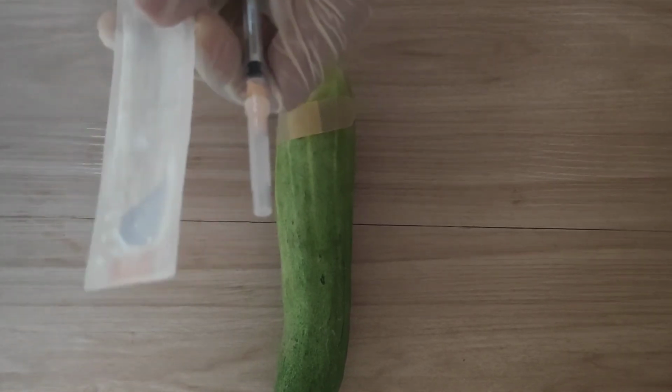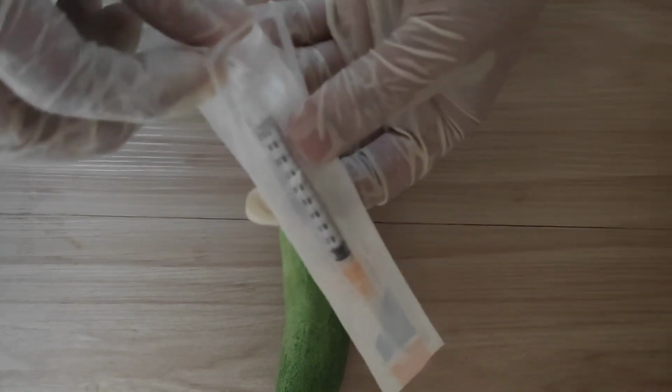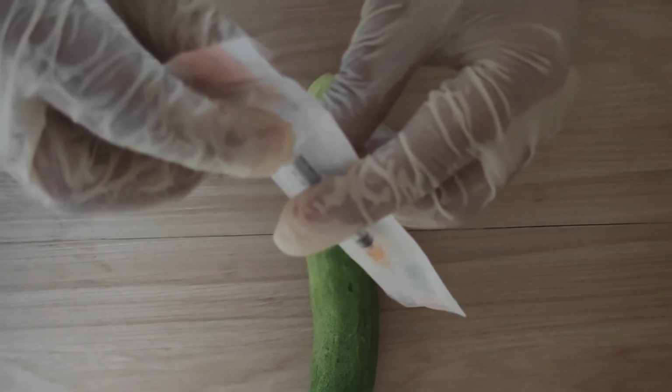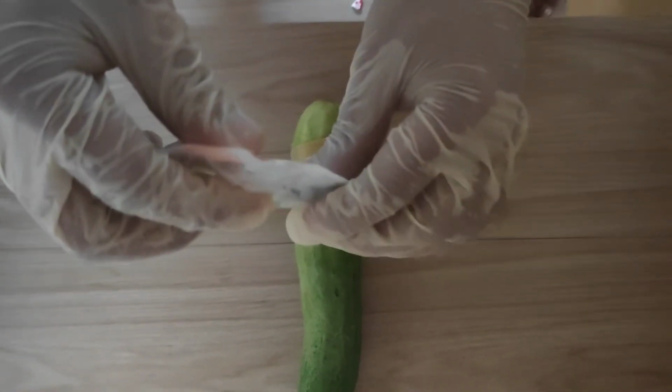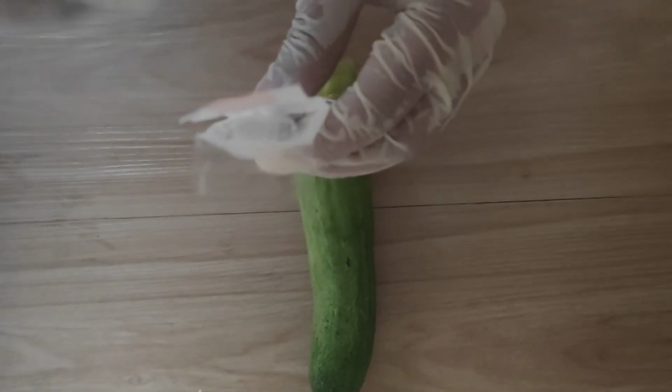Next, label the specimen, complete the appropriate laboratory requisition, and note the percentage of oxygen therapy if applicable, and the temperature, especially if elevated, at the time the specimen was drawn.